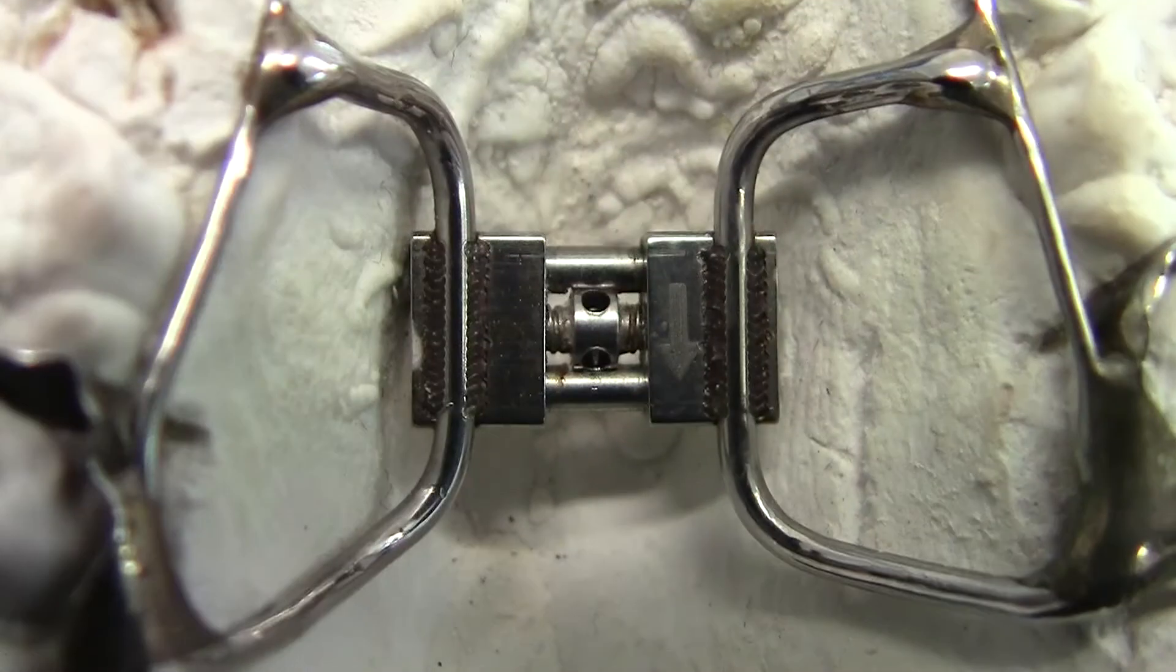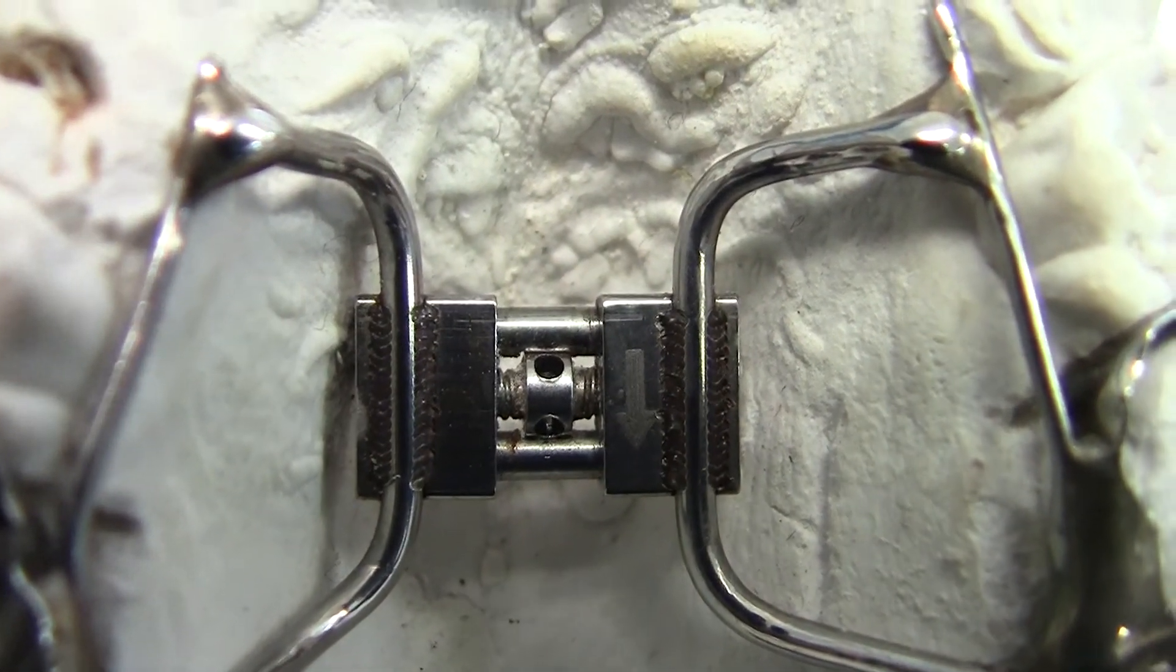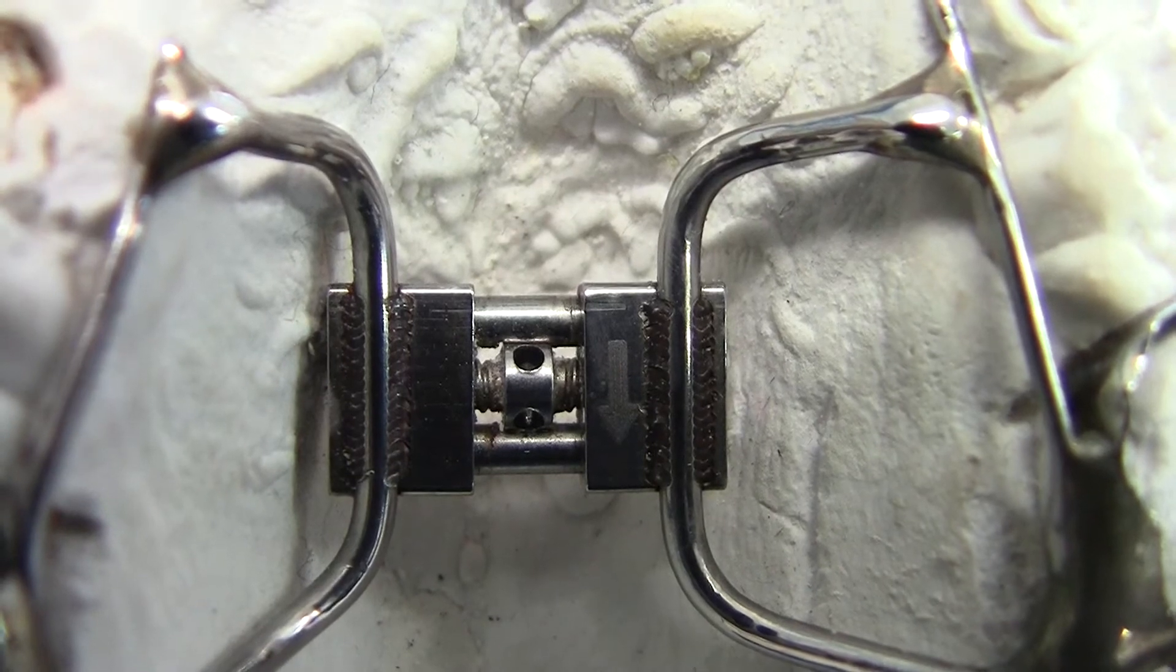Located in the center of the expander you'll see a little keyhole with an arrow on either side. This shows the direction the key needs to be pushed in.